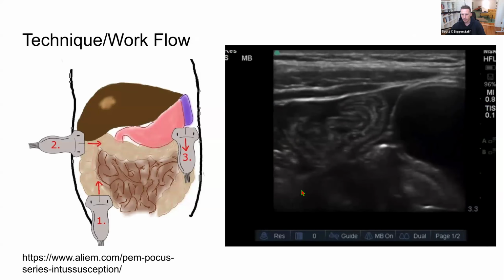Let's say that you get paged at 2:30 in the morning, you show up with a probe and are able to save images and then page radiology and say, hey, I think this patient's story is in line with intussusception. This is what I saw at the bedside. Can we prep for an air enema for them? And then again, rural and international work. I think I repeated that in all of the use case slides because it's obviously a handy thing to be able to do in settings like that.